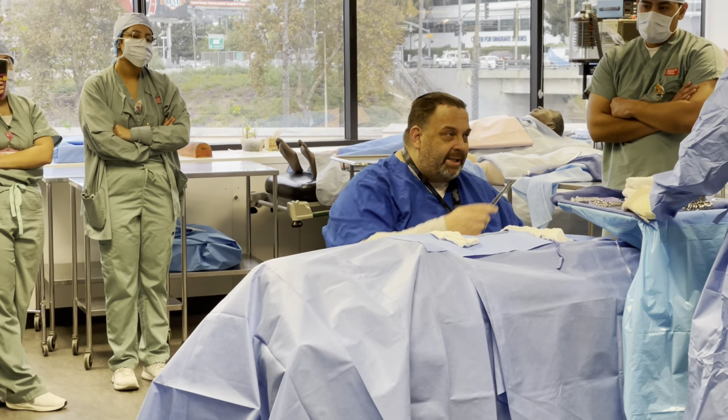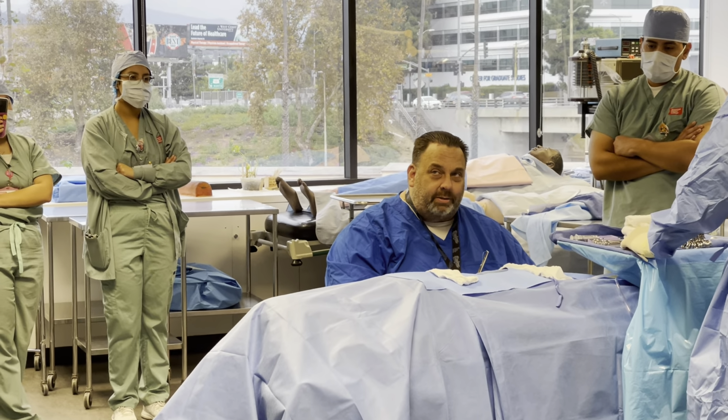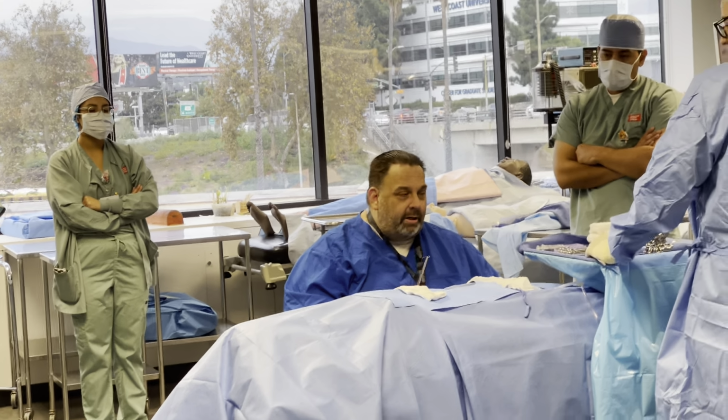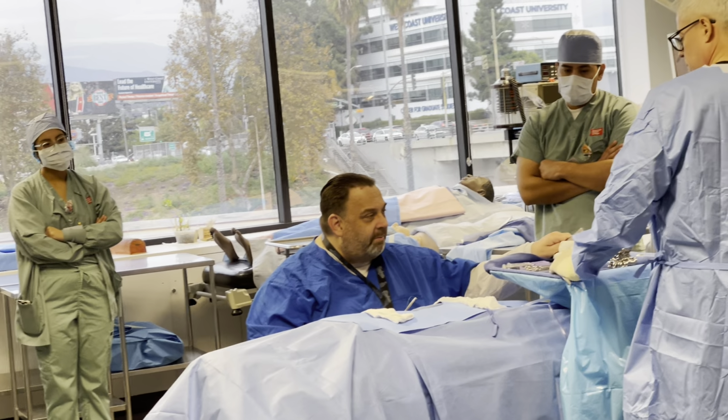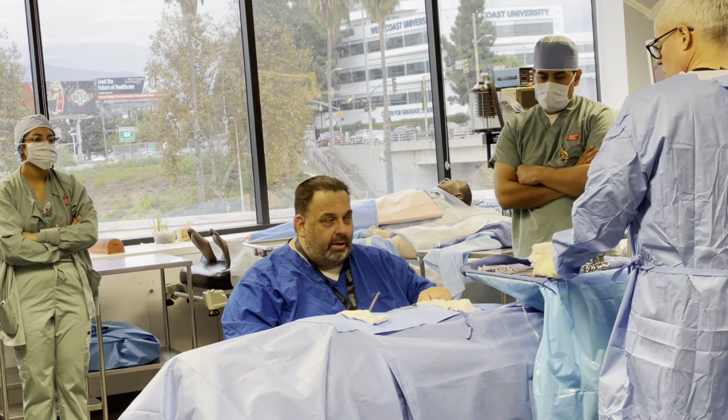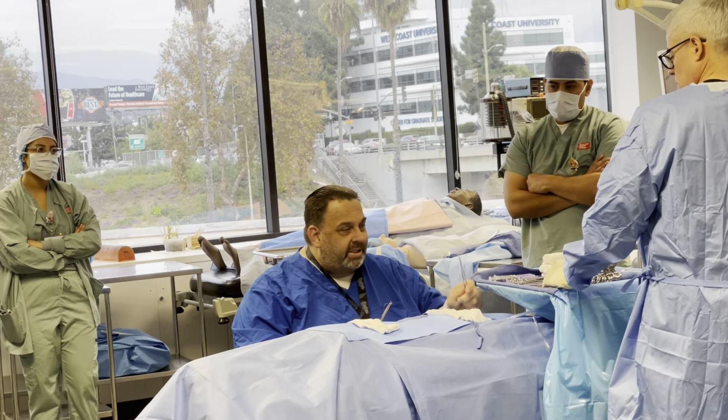That clues in the tech to know that he's now going to do the next count. We do 3 counts during surgery, all right? The first count is done when we set up. The second count is done when we start to close the peritoneum, okay? So this is now called a full count. We're going to start with our laps. Now watch how it counts.